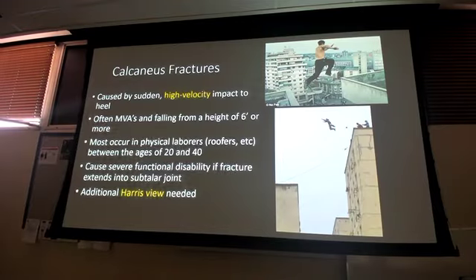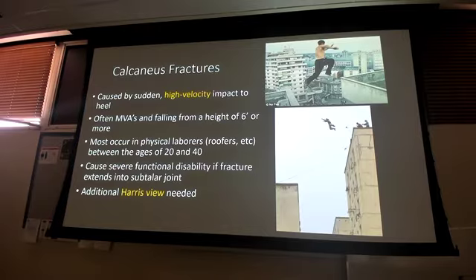Because if something like this happened, that energy had to go somewhere. And more often than not, it goes to the lumbar spine. That's what takes the brunt. And that's where you're going to see a potential compression fracture in somebody who's maybe not osteoporotic, or maybe a burst fracture from the high energy impact, something along those lines, right, if you're going to have this.